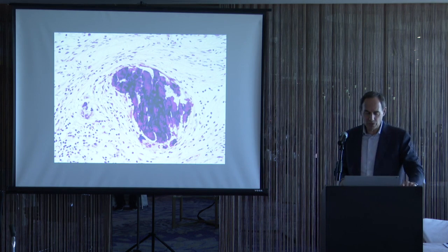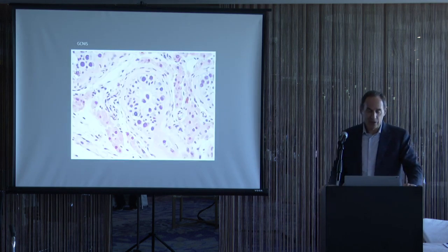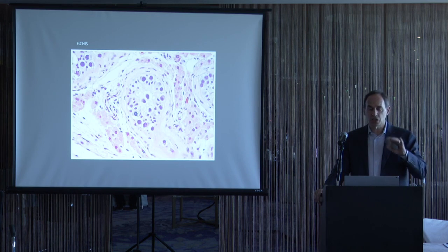This is what I mentioned when you see these dense, coarse calcifications. That also strongly favors that this was a regressed germ cell tumor associated with a scar. Now, if all I see is a scar, some calcifications, and the surrounding testis shows abnormal spermatogenesis, what I can end up saying is that's highly suggestive of regressed germ cell tumor. I can't be 100% definitive unless there are metastases.